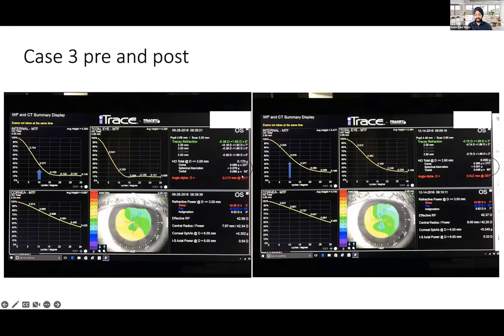There's refraction. And you see the same thing here. You significantly increase to normal from 40% to 60%. You now have increased the patient's modulation transfer function. And the topography, no significant changes on astigmatism, refraction, etc. So these are some examples of what we can see.